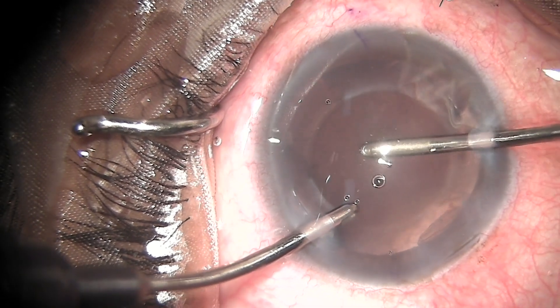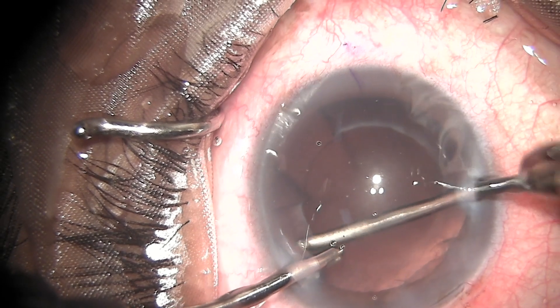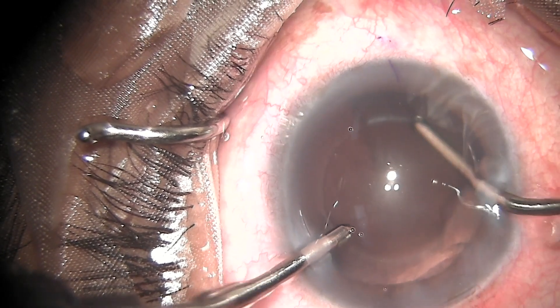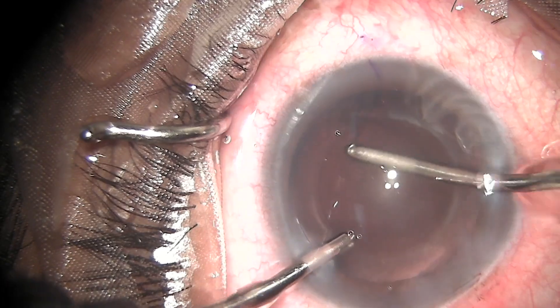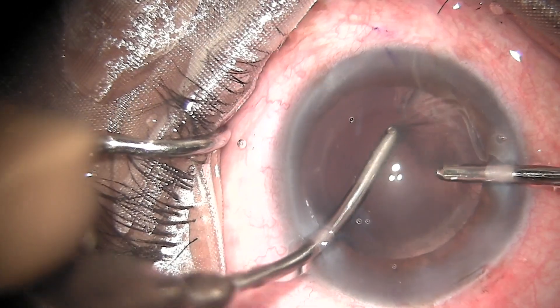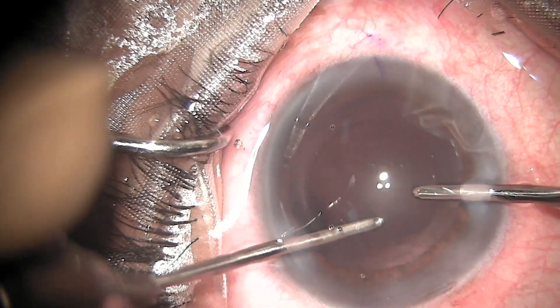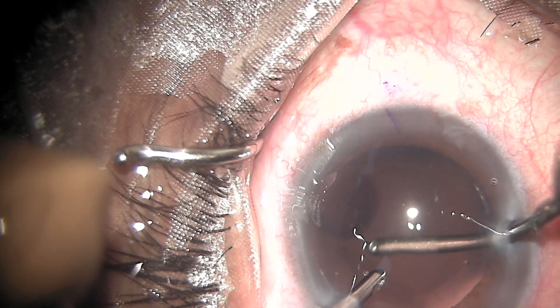Now I am removing the cortex with bimanual irrigation aspiration. This cortex is stuck to the anterior capsule, so you have to actually peel it off, unlike your routine phacoemulsification cases. I reverse my probes and remove it from the other side.